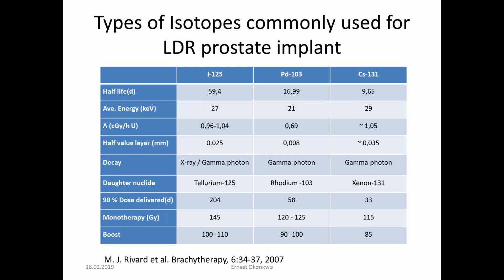It's important, when you decide to do something different from the recommendation, that you can back up why you are doing that. And if you are doing a boost, then we do 110 gray, which is recommended here.